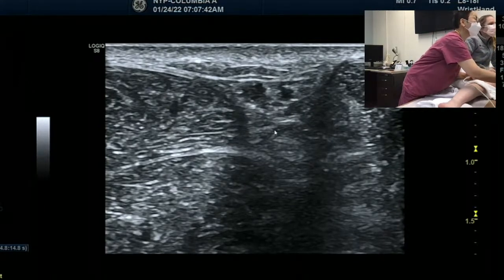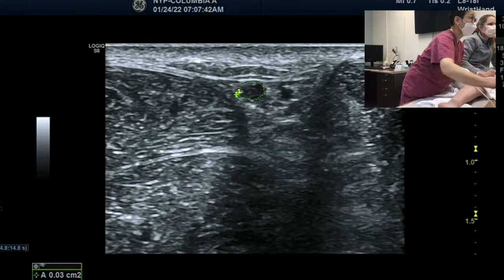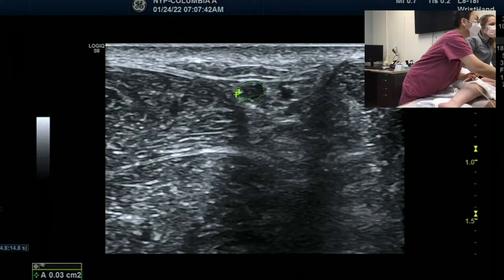So if you guys look at it, cursor here, major. I'm not measuring, but I took it for me to show. This is the small saphenous vein. Looks big to me. We saw the evidence, there was blue color going back and forth. At this time, blue doesn't mean anything, but the flow is away from us. Then I'm gonna clear, then move to this one here.